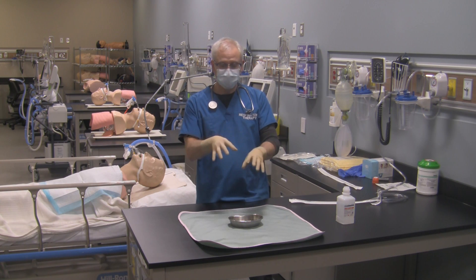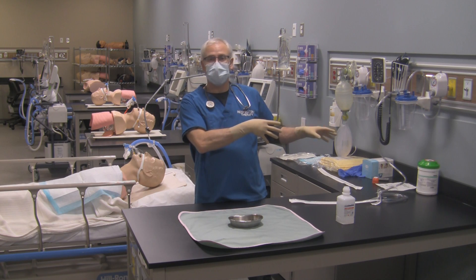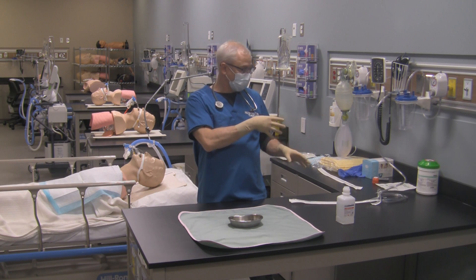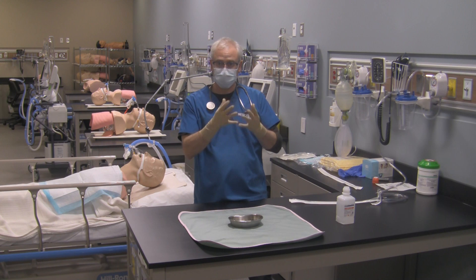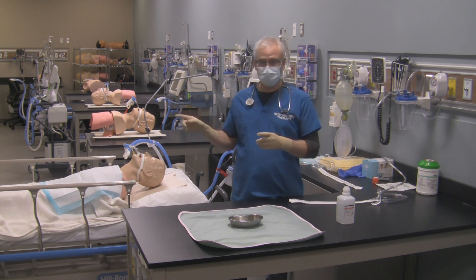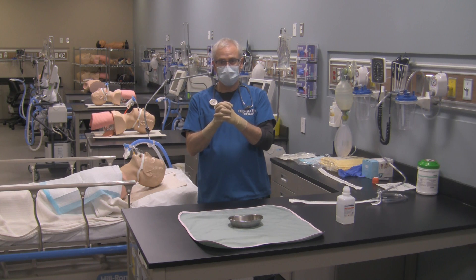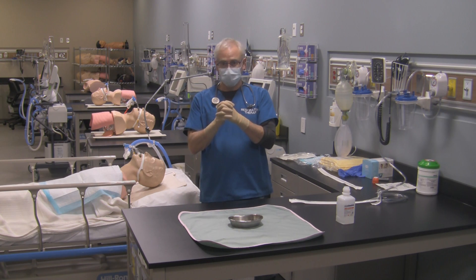I've already got my sterile field set up. I've already had my suction tubing hooked up to my suction catheter, so that's ready to go. Remember, before you start using a suction catheter on a patient, make sure you've got the correct size of suction catheter for the size of artificial airway that is inserted in your patient.